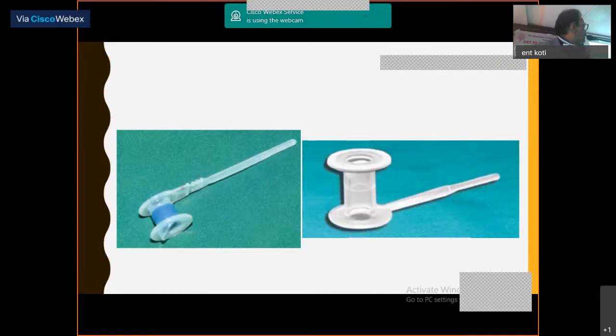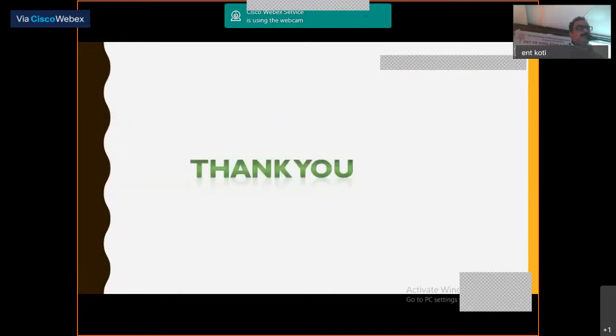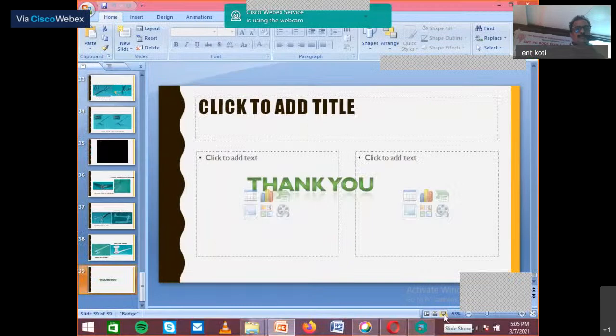What is this process? This is post-laryngectomy voice rehabilitation. No? This one, the two tubes here, that is Blom-Singer. This one, Provox voice prosthesis, Blom-Singer prosthesis. That is a puncture, primary and secondary, that was discussed. So these are the few instruments I thought I will show you. Then some of the radiology.